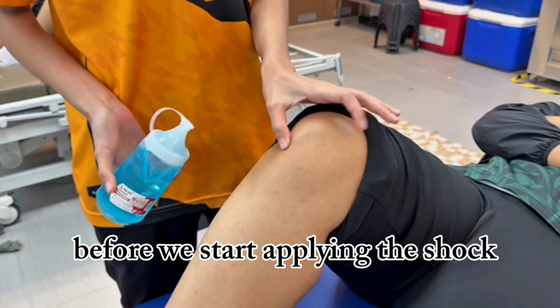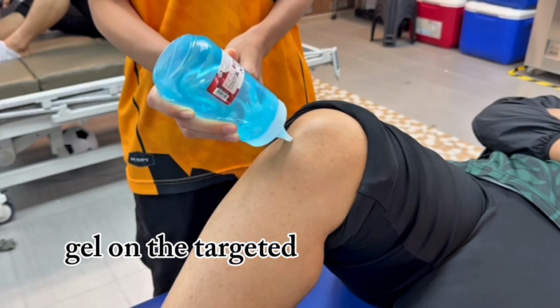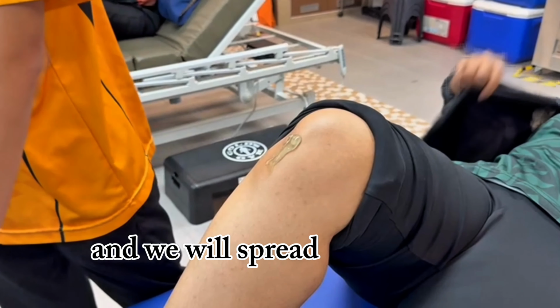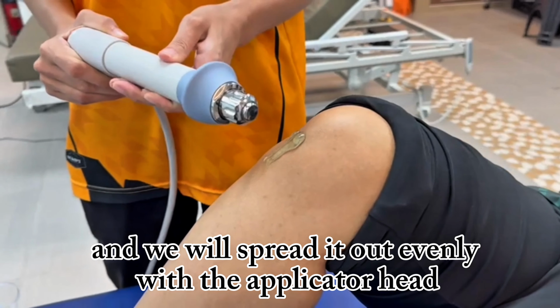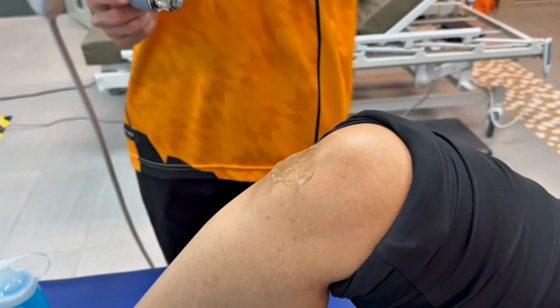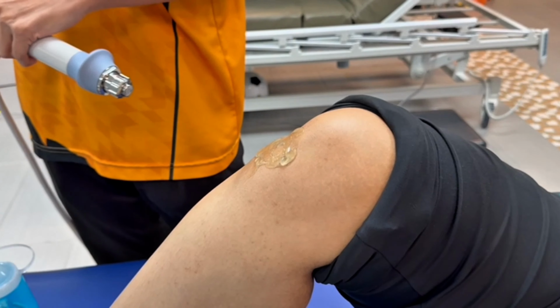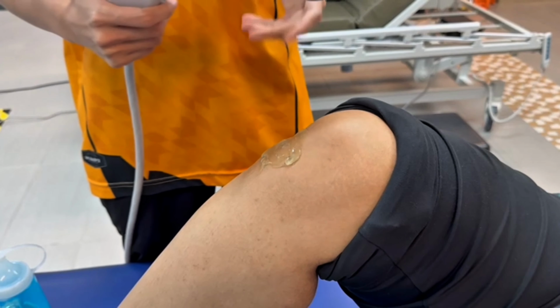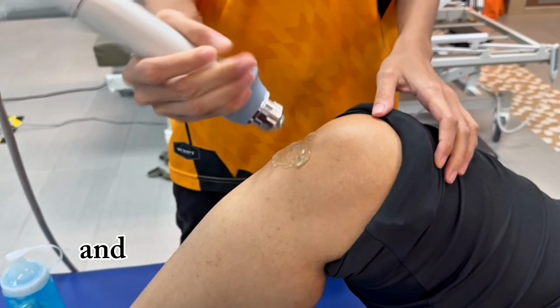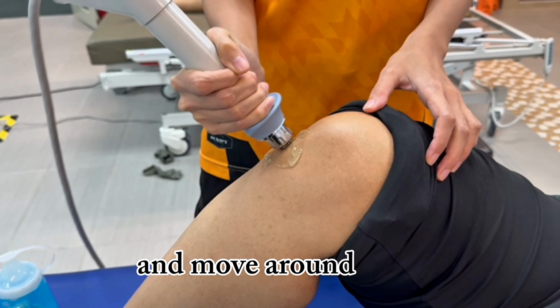Before we start applying the shock wave, we will apply a layer of ultrasound gel on the targeted area, the patella tendon, and we will spread it out evenly with the applicator head. Then press the button on the applicator and start applying slight pressure on the injured area and move around slowly.